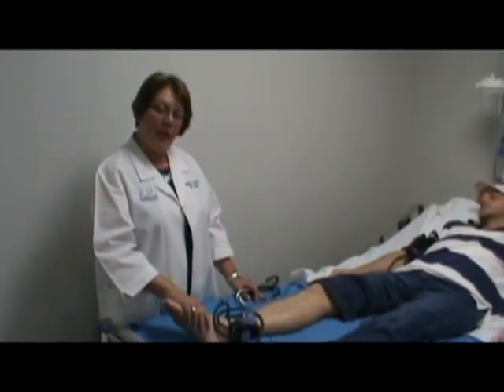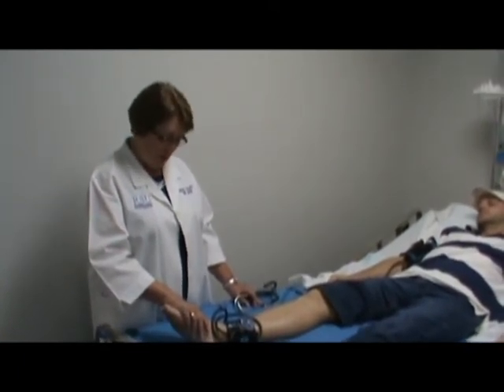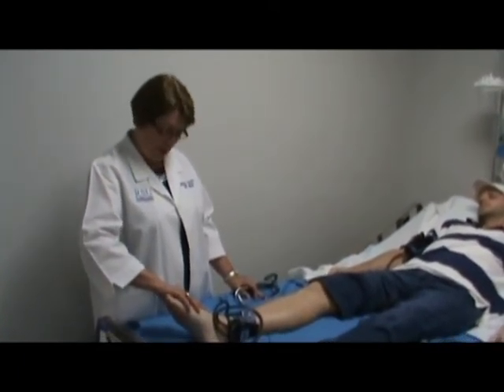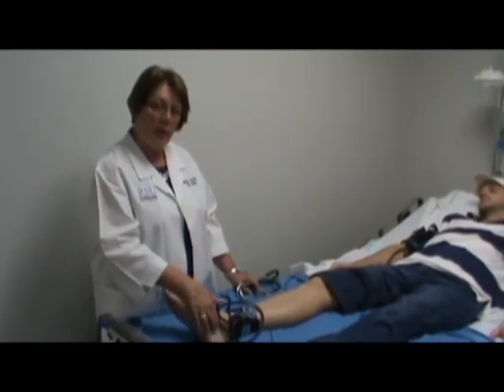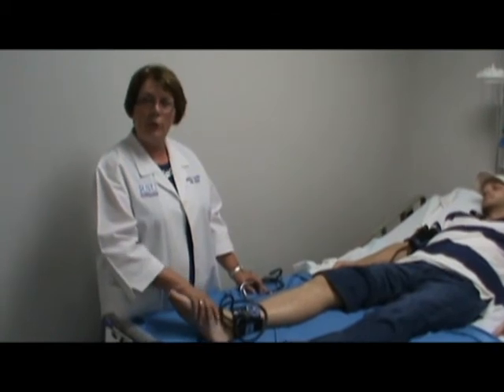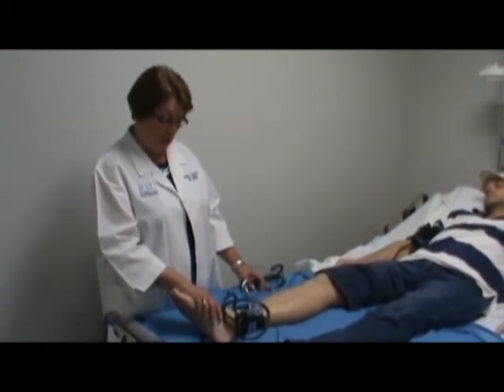Remember, when you're taking an ankle pressure, you need to make sure that you have a good pulse. Mr. Miller has a very strong pulse. You can look at the dorsalis pedis or the posterior tibial. If you are unable to feel the pulse, then you need to get a Doppler. That's why we have it listed for equipment.